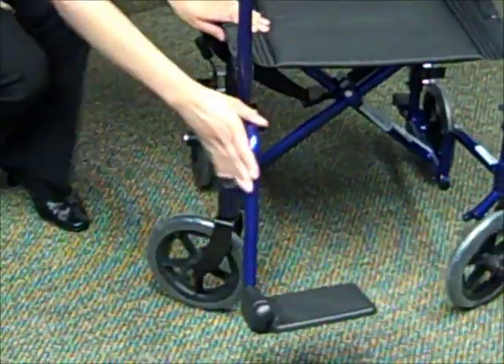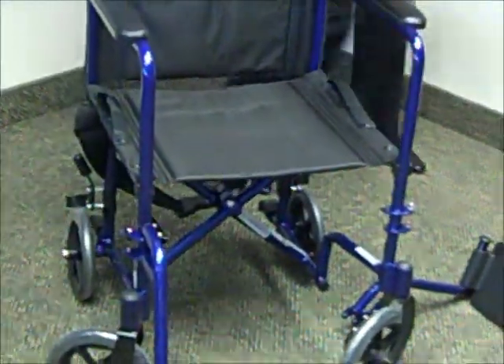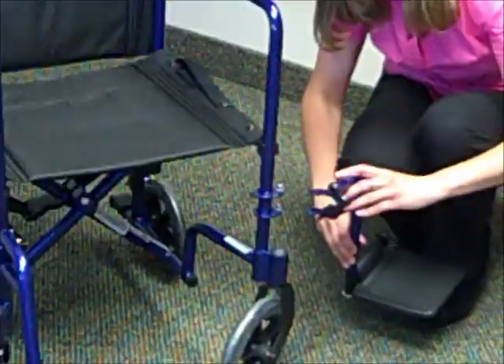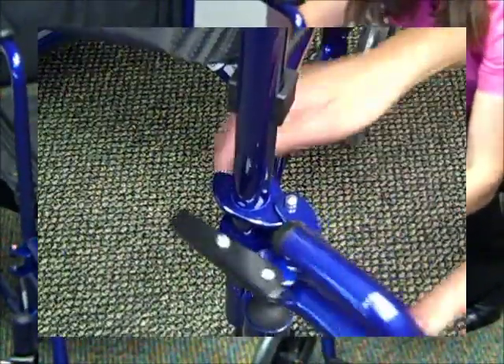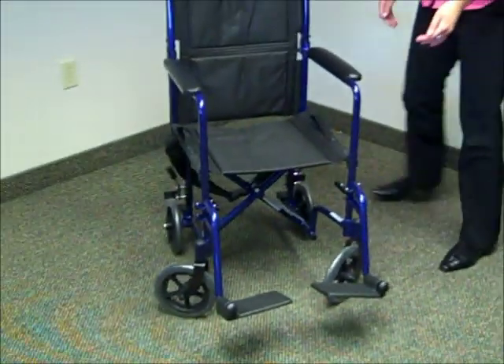You also want to make sure those click in and they're nice and secure. Go ahead and assemble the other footrest. Make sure you hear that click. Now your chair is assembled.